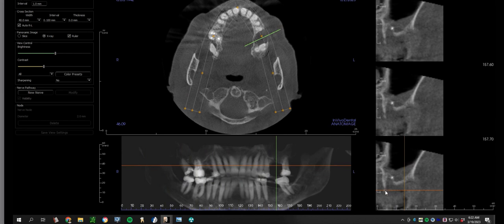When you remove a tooth, you're not going to have bone fill past the most coronal extent of the alveolar socket, which is this guy right here. Sorry, there's a little lag with the computer. So, best case scenario, and I doubt it's going to go this high because of how deficient it is on the buccal, I think you're probably going to end up with something like this. Again, I'm thinking about the future alveolar ridge of this particular site. The head of the implant is where this orange line is. Then you're going to have a very large crown on top of that.